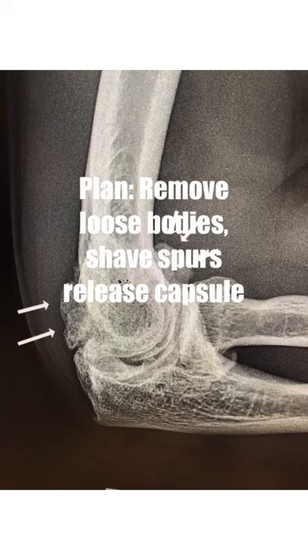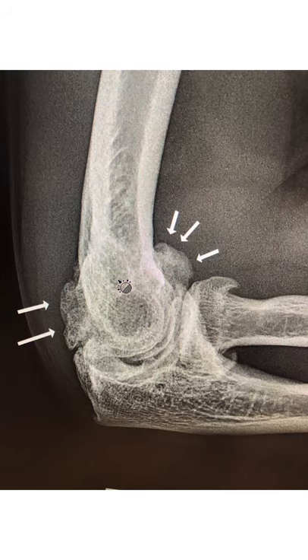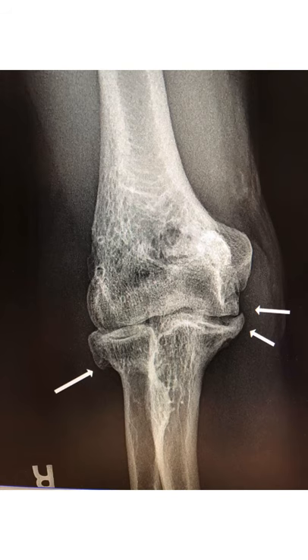Once my two portals are established, I can evaluate the joint. My goal is to shave down spurs, find all the loose bodies, and address the tight capsule. This picture shows the spur formation in the front and in the back, and some loose bodies.